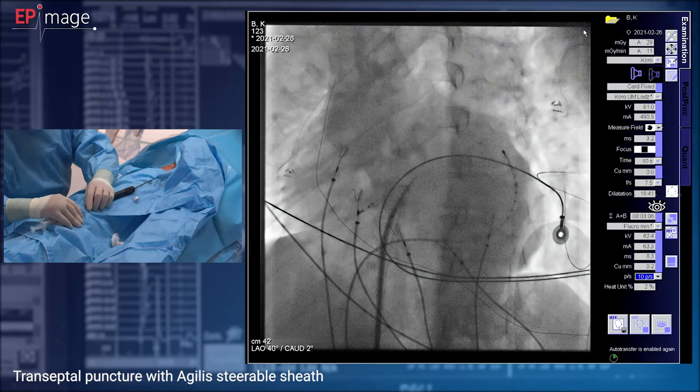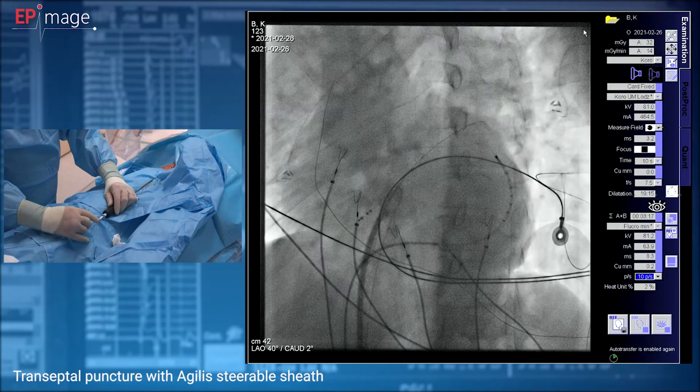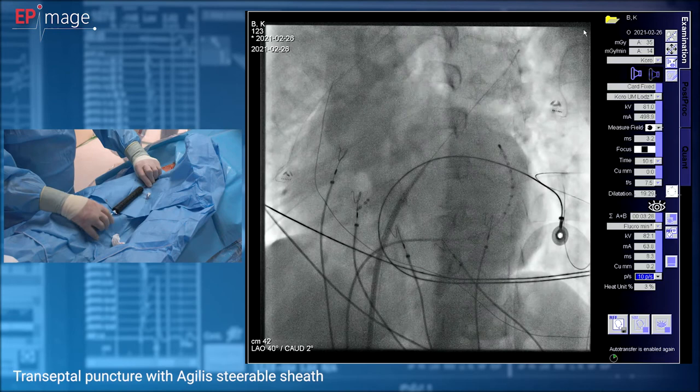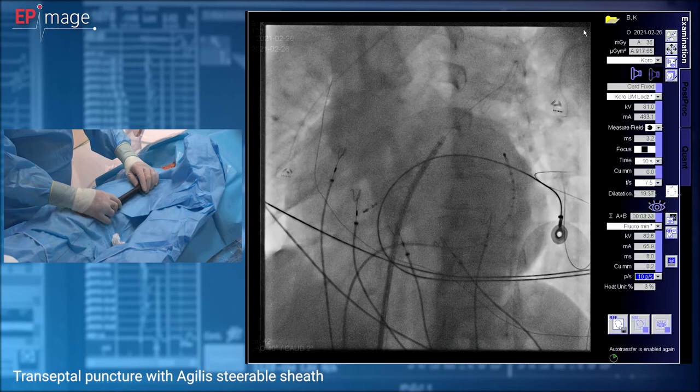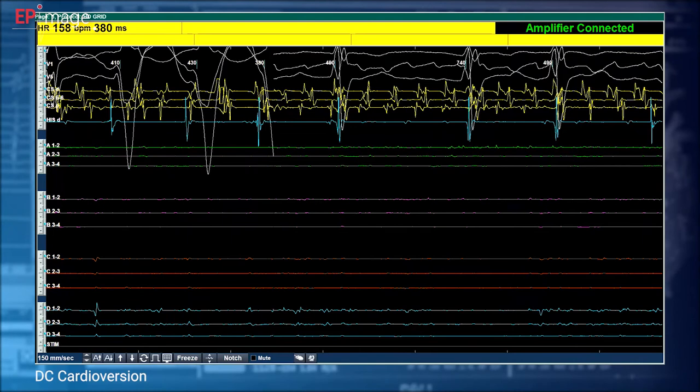I'm not pushing the system further before I introduce the guiding wire, which I place in the left superior pulmonary vein, and over the wire I am pushing the system forward to get the sheath inside the left atrium. So we are through, we are in the left atrium. Now the ablation catheter has been introduced.